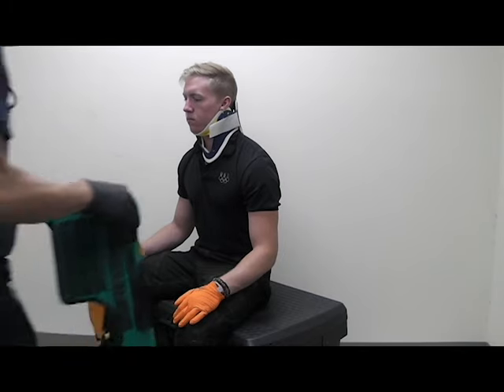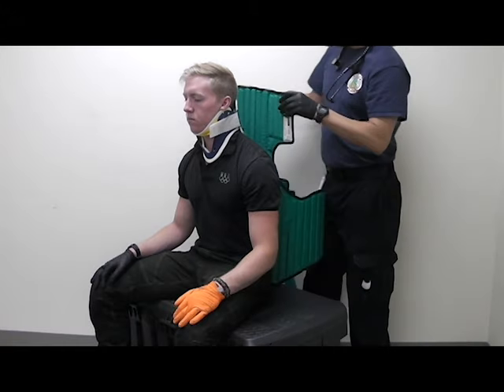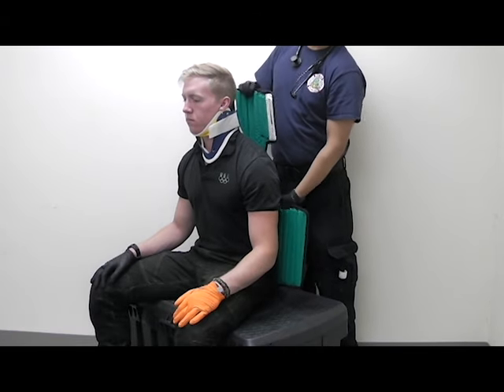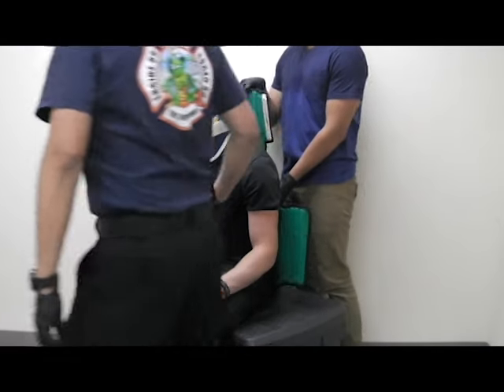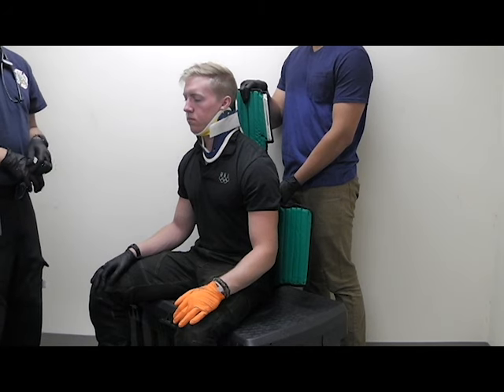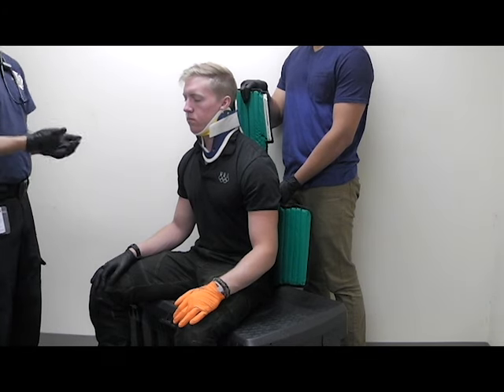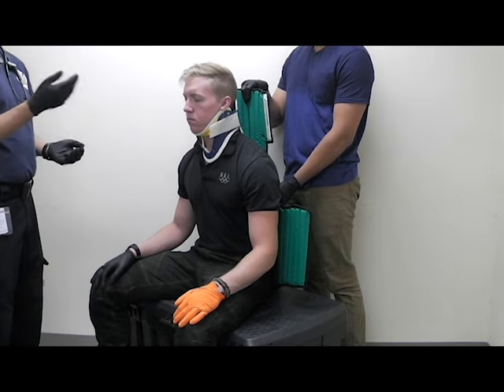Once you place the KED behind the patient, you're going to have your partner hold it. Once the KED is in place, you're going to follow this order for straps: middle, bottom, legs, head, and then top.